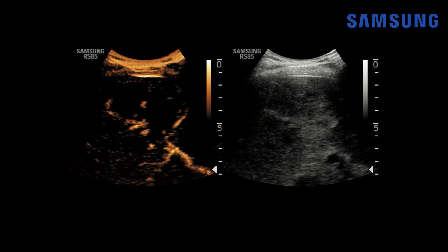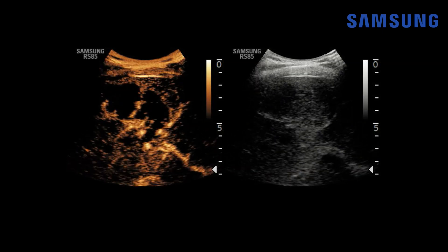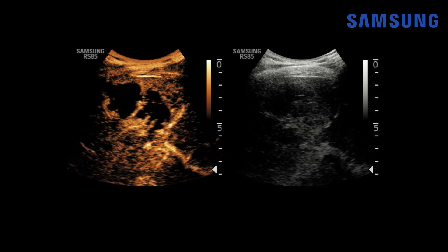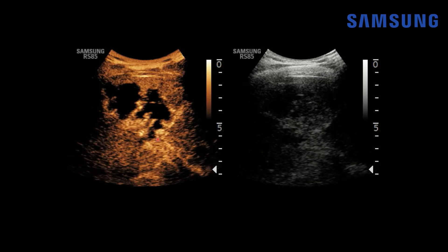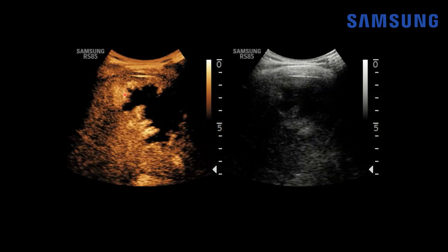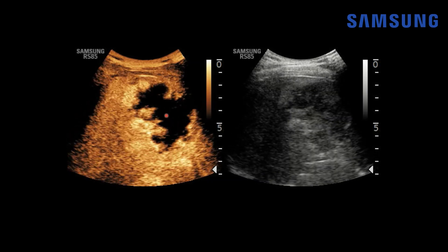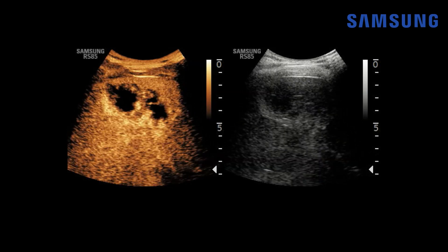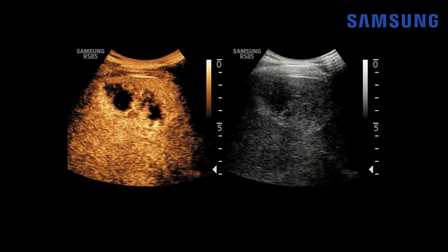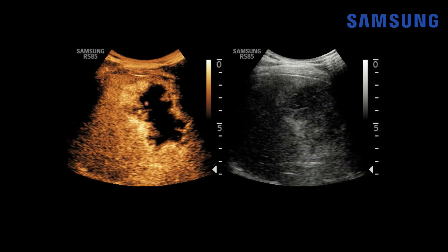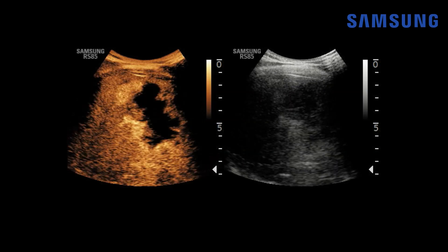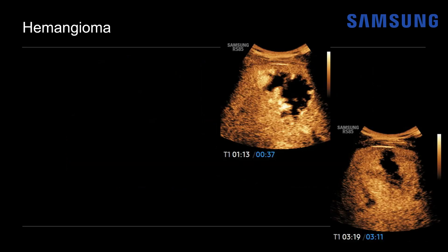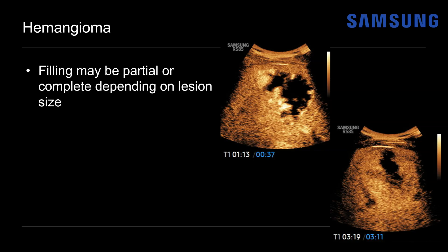On real-time imaging, shortly after contrast injection we see peripheral globular contrast enhancement with gradual centripetal progression. By about 30 seconds post-contrast there's still a lot of hemangioma to fill in, but we're not seeing any areas of washout — just areas centrally that are not yet filling in. That can be normal for larger hemangiomas. Even by five minutes, this hemangioma did not completely fill in.